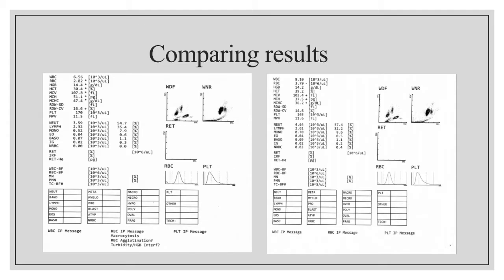We want to compare the pre and post saline replacement results to ensure that we haven't altered any of the platelet or white cell counts. When removing the plasma, it is possible to accidentally remove some of the platelets if you get too close to the buffy coat. In this case, it does not look like we have altered either of these counts from their original values. They are essentially the same across the board.